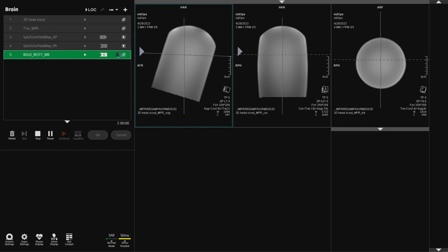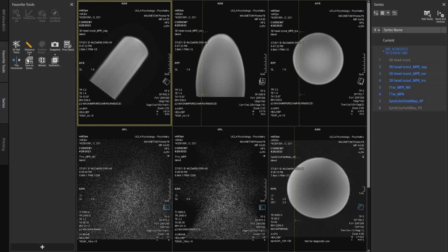And what I'm going to do is click over to the MR View and Go. Now, from the previous video, you'll have seen that there was the open participant that was still scanning, and then the MR View and Go tab. An MR View and Go tab will open up automatically once a participant is registered in the system, so data can continue to stream in to the View and Go tab as the data is being collected. Right. So I'll click over to the View and Go tab.